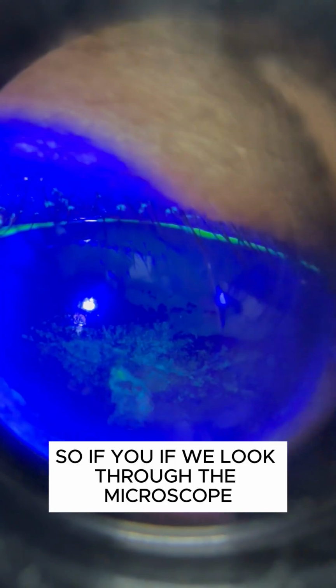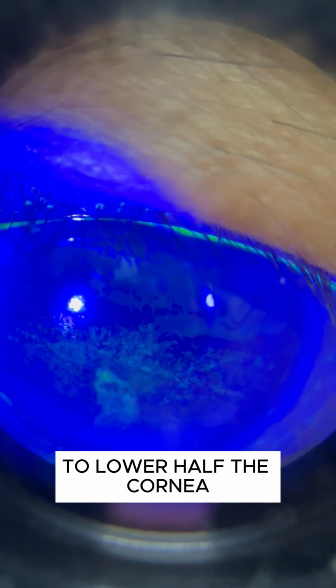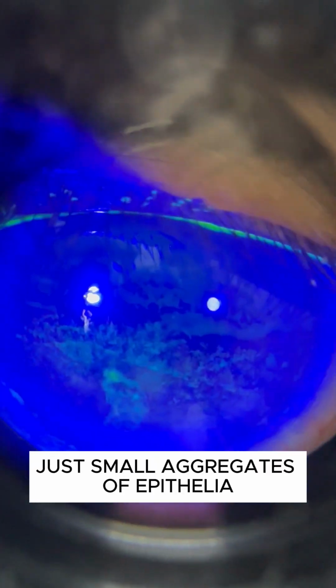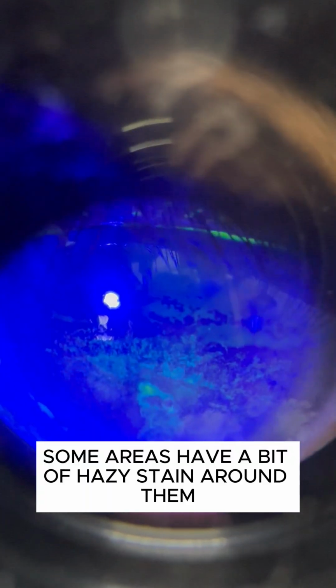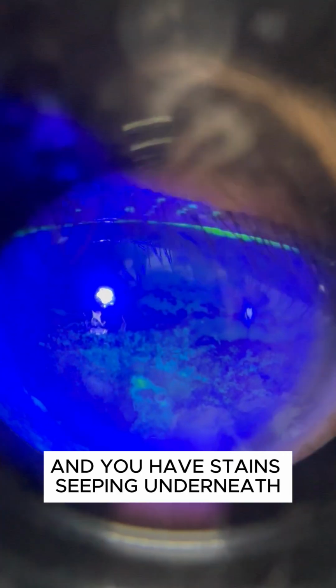So if we look through the microscope, this is basically what you expect an exposure keratoconjunctivitis to look like. The lower half of the cornea, he's got diffuse staining there. Some of it's starting to coalesce, and you're getting small aggregates of epithelial loss and microerosive defects. As you can see, some areas stain more brightly than others. Some areas have a bit of hazy stain around them, and that shows you that the epithelium is loosely attached and you have stains seeping underneath. So his stage is set to worsen here.